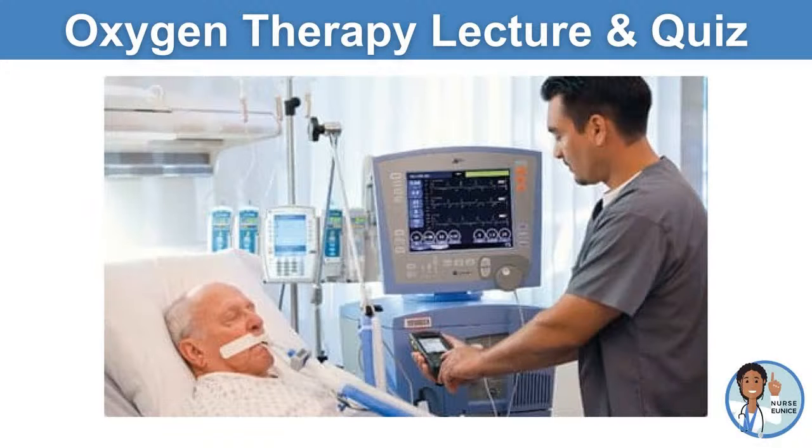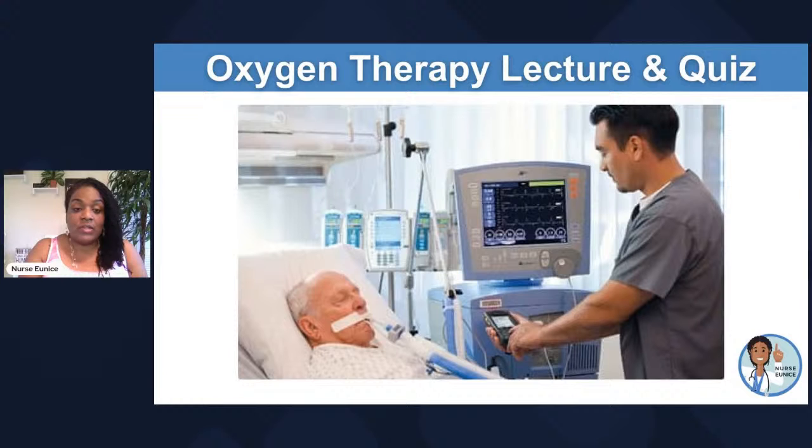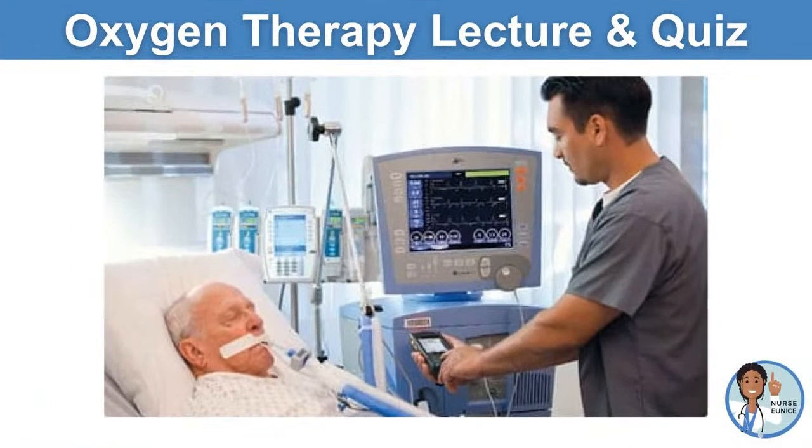And our job as caregivers is to make sure that that tube doesn't become dislodged, and that we suction that patient because they're unable to clear their mucus or their secretions. And then one other thing, if you look at the image and look at the positioning, it is rare that we have somebody who is intubated flat. We may have them flat or in the supine position while we are positioning them, repositioning them.